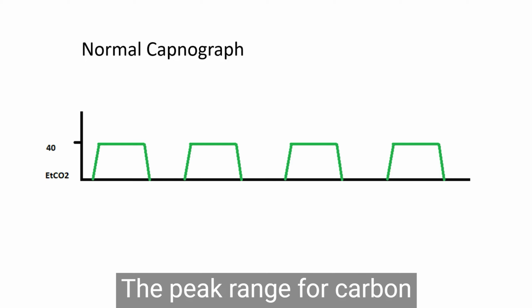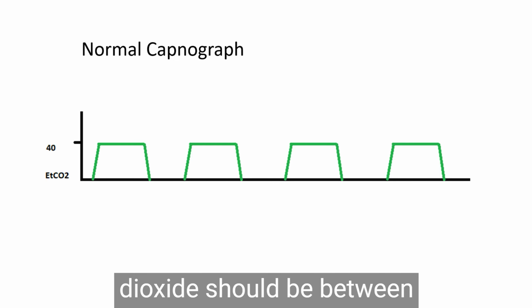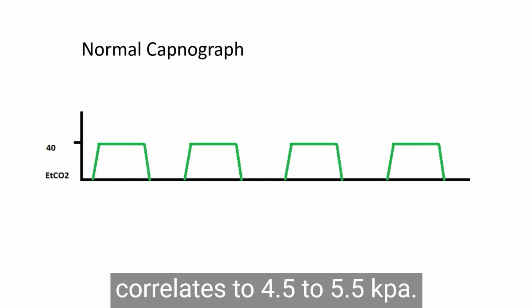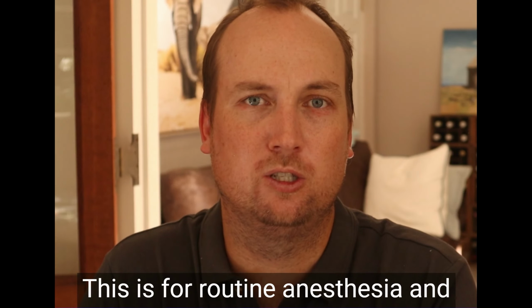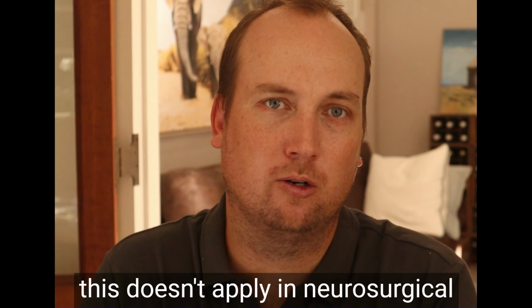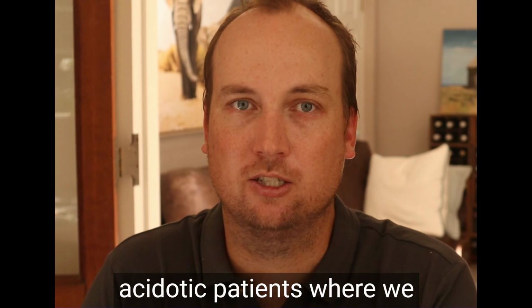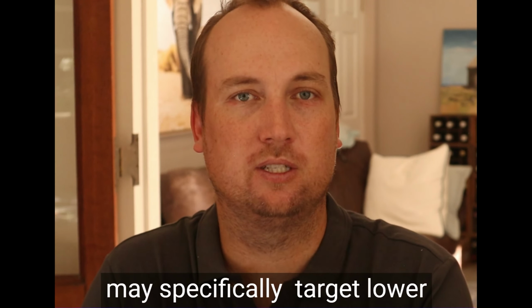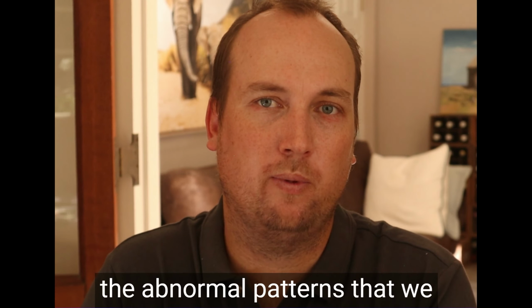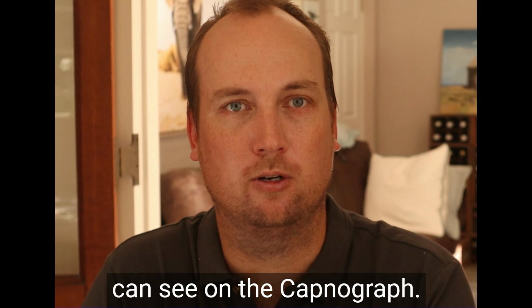The peak range for carbon dioxide should be between 35 to 45 millimeters of mercury, and that correlates to 4.5 to 5.5 kPa. This is for routine anesthesia, and this doesn't apply in neurosurgical patients or in shocked or acidotic patients where we may specifically target lower carbon dioxide levels at times. So let's go through some of the abnormal patterns that we can see on the capnograph.